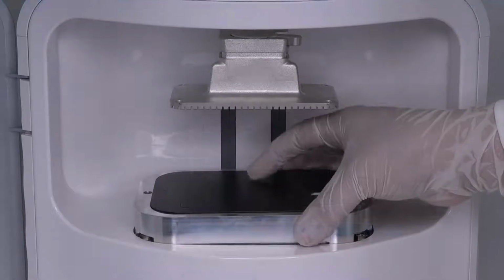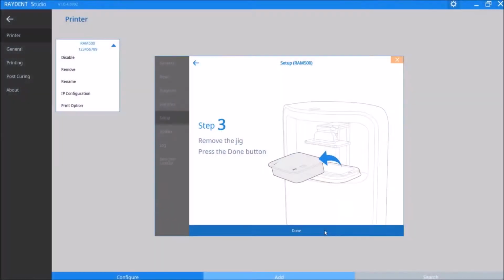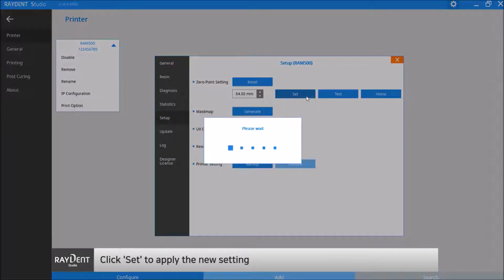Step 3. Remove the jig attached to the printer and click Done. Now the 0 point setting will change to the new calibration value. Click Set to save the edited calibration value.